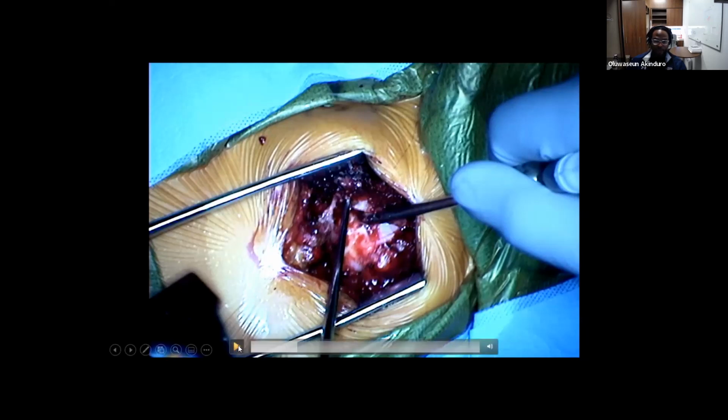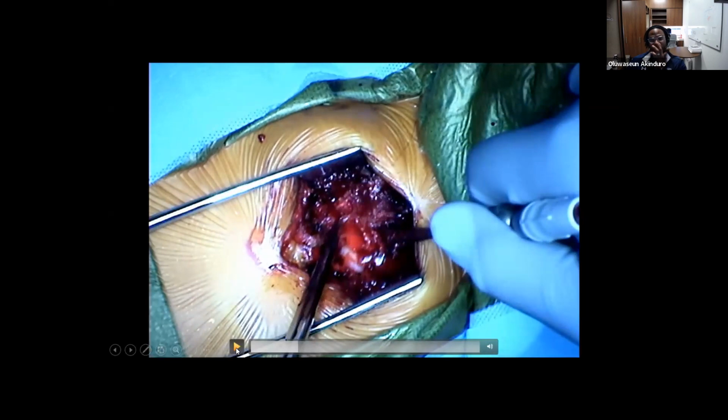And the other thing is knowing the starting point for the lateral mass screws. You want to start off by imagining the lateral mass as a box, and the simplest way to do it is to put a point right in the dead center of that box. Usually maybe cheat slightly more inferior and medial, but at the end of the day, you'll be safe if you go smack dab in the middle of that, and then you're aiming for the upper outer corner, following along the trajectory of the joint itself.